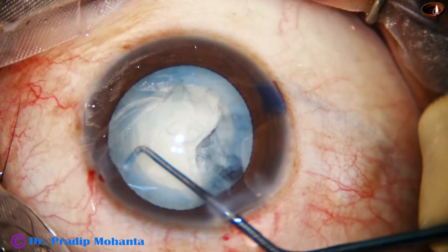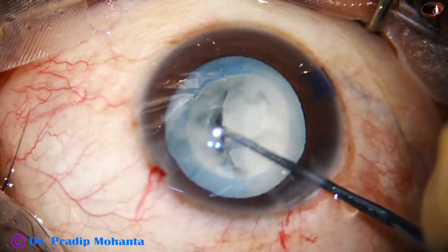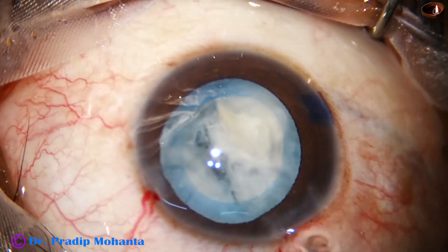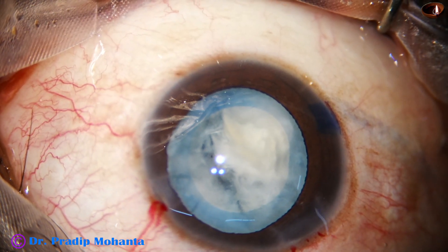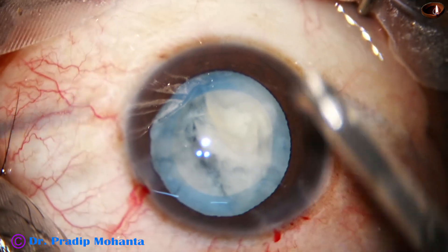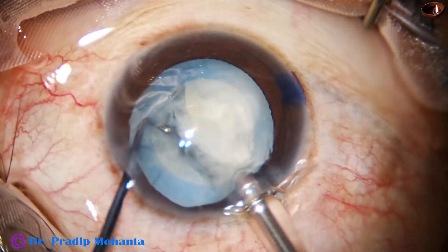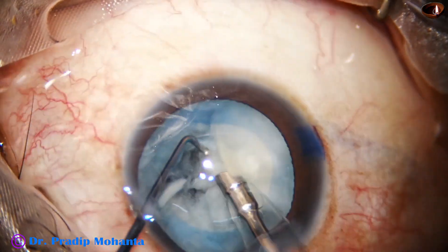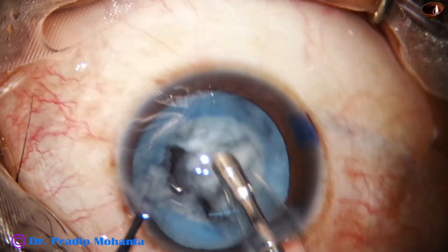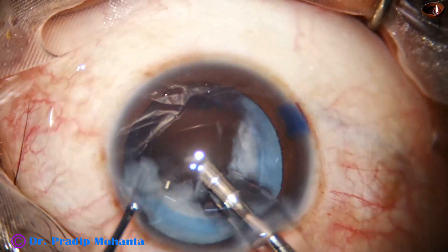I take the nuclear sustainer, rotate it a little bit, and by the sustainer itself I pull the nucleus out of the bag. By the sustainer itself, it gets cut — it is so soft I don't even need the pre-chopper. The sustainer is a round-bodied instrument with a ball at the tip.